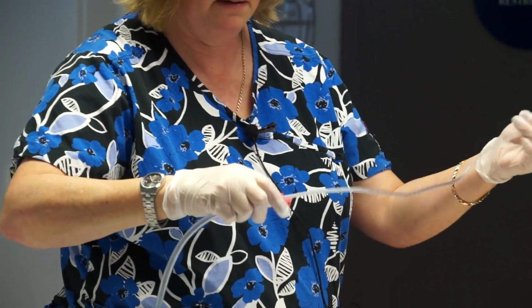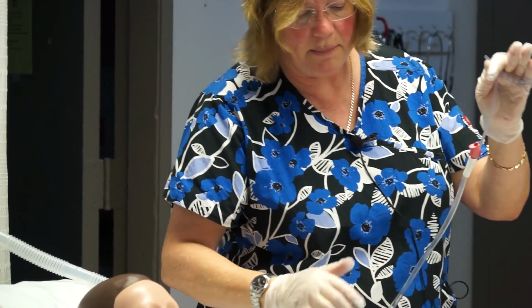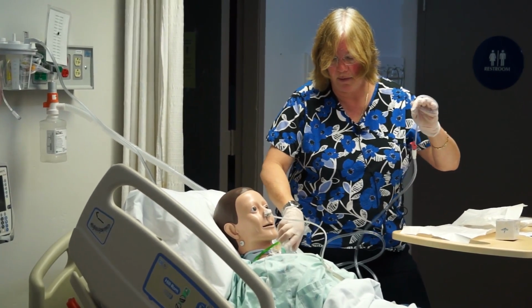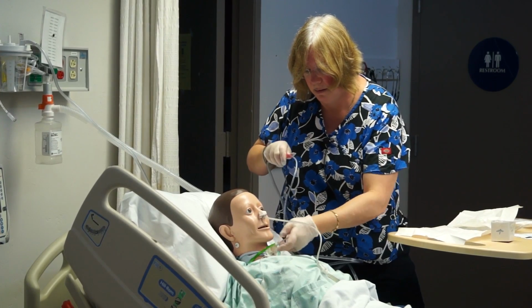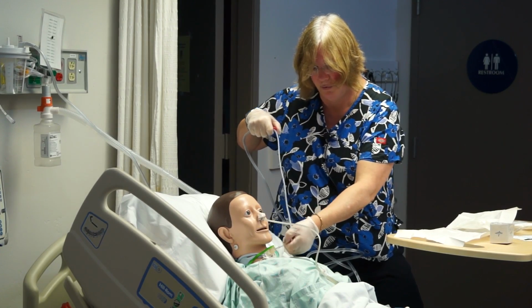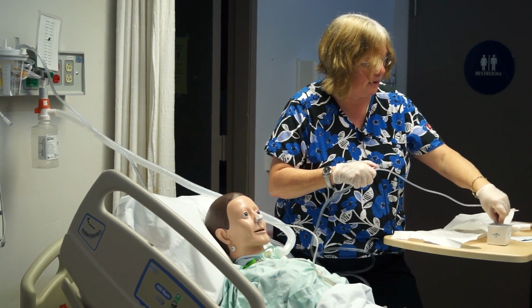Pull this out. I'm going to check my suction to make sure, and moisten my tube. I always moisten my tube so that I can then pull the oxygen off my patient. So I'm going to pull the oxygen off my patient, unwind it, go down, coughing, apply suction and coming out. I'm going to put the oxygen back on so that the patient can oxygenate.